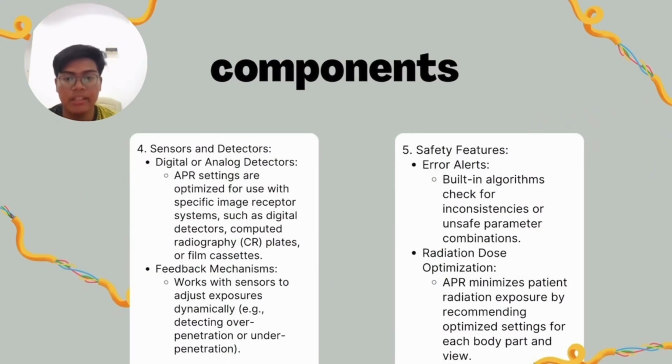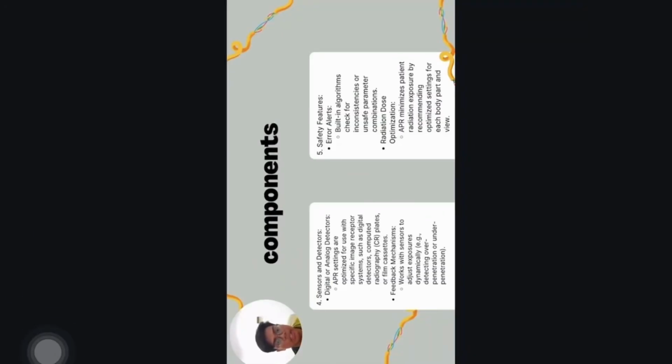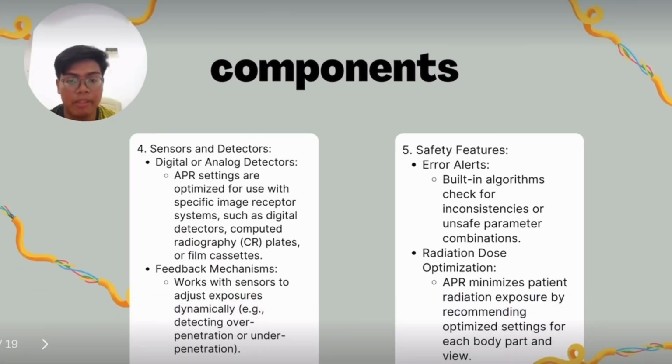Next, for the sensors and detectors, digital or analog detectors ensure the APR settings are optimized for use with a specific image receptor system such as detectors, computed radiography (CR) plates, or film cassettes. For the feedback mechanism, it works with the sensor to adjust exposure dynamically, such as detecting overpenetration or underpenetration. Last but not least, the safety features of the APR components are error alerts, and a built-in algorithm checks for inconsistency or unsafe parameter combinations. For the radiation dose, it will optimize the radiation exposure by recommending optimized settings for each body part for the patient.